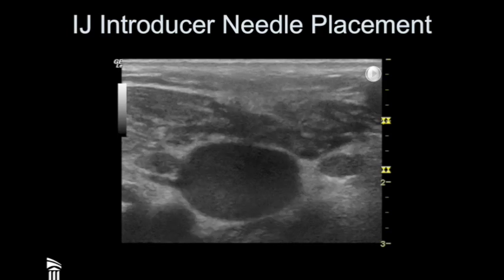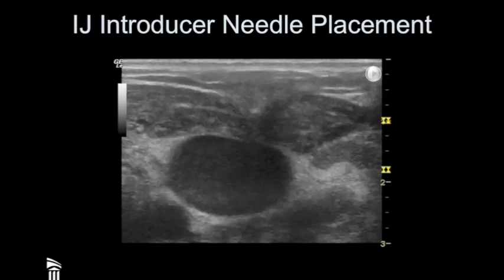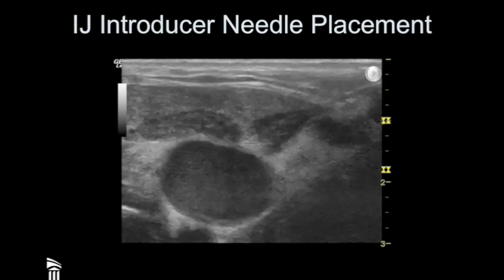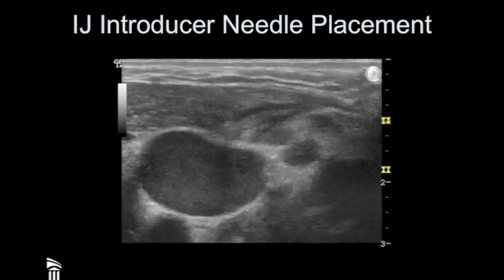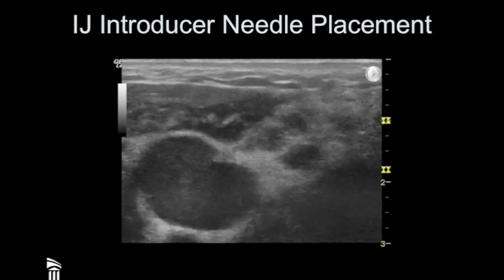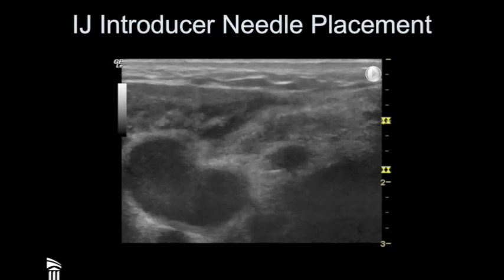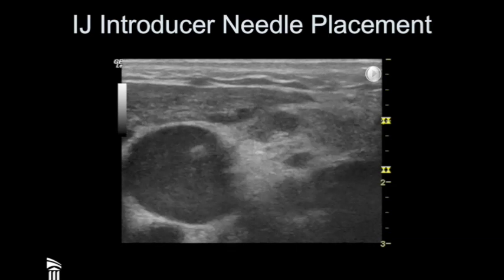This video clip shows a central vein being catheterized in transverse — personally I prefer the transverse. One thing to note is how large that vein is. It's very easy to do this procedure with ultrasound guidance because those vessels are just so big.